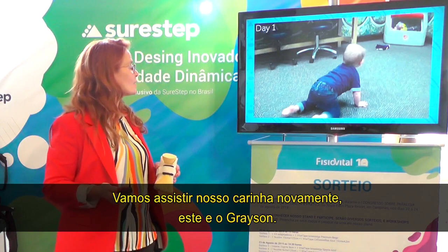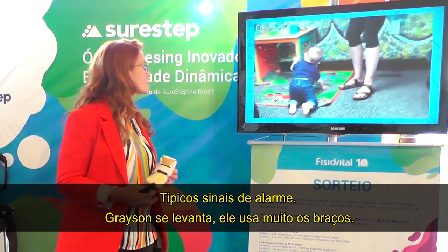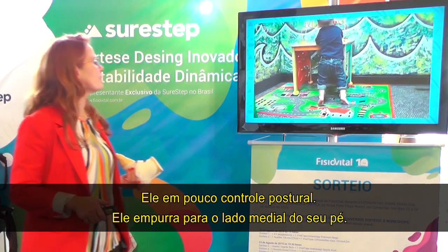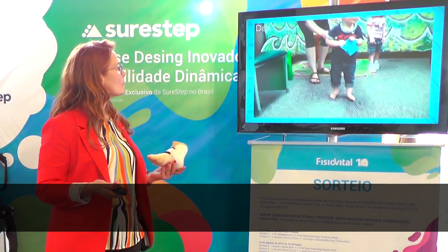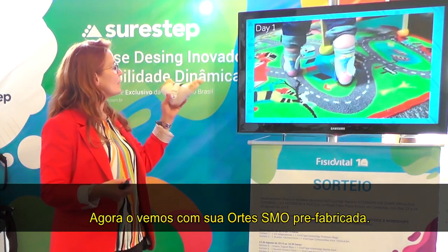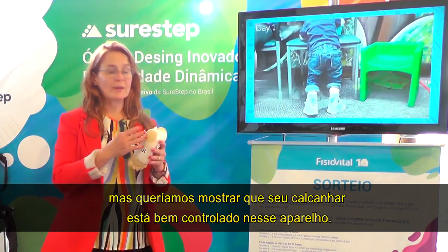Here's Grayson. Grayson is crawling and W-sitting — really typical warning signs. When he first gets up, he uses a lot of arms to get himself up; he has poor postural control and pushes through the medial side of his foot. He goes into a rigid position to reach for something so he can be stable. Here he is trying to walk — he just keeps his weight line medially, and it's really hard for him to shift his weight enough to initiate a step. Here he is with his prefabricated SureStep SMOs — the calcaneus is well controlled in this device.